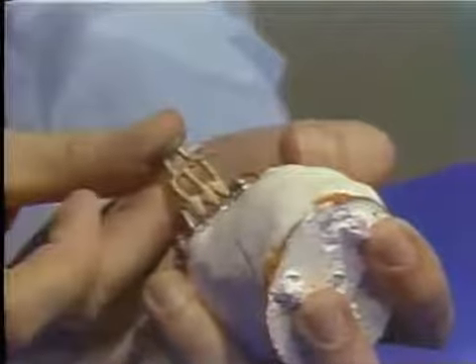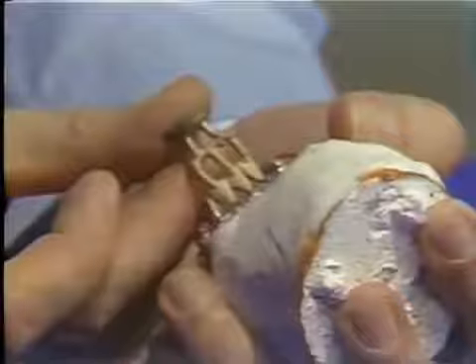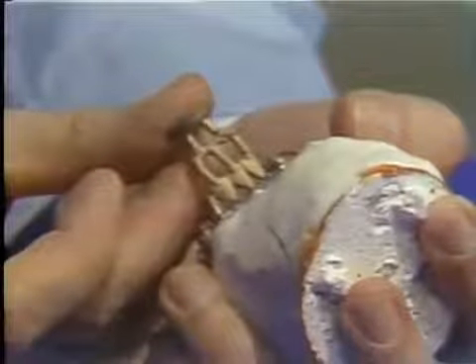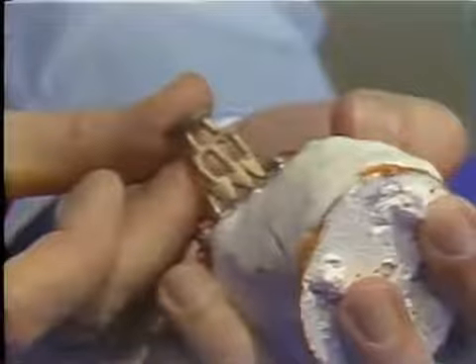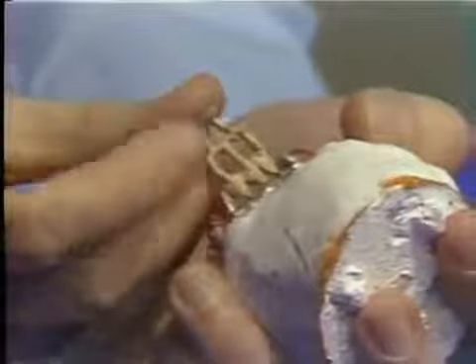cuspids there, and this is a casting with the sprue still in position of the gold cores, which when they're finished are going to be used to carry the porcelain overlay when it's fused on here in the furnace. These particular Pontics have been cast as one unit, as you can see, so that when they're finished, soldering is only necessary at each end of the string of 3 Pontics.